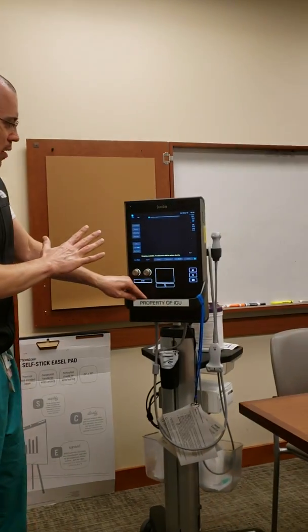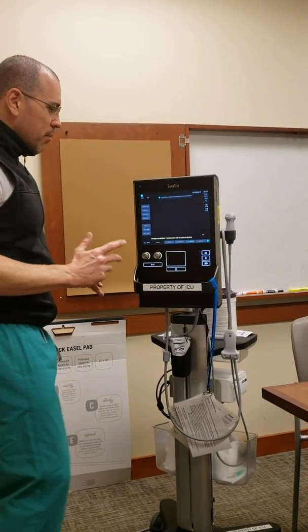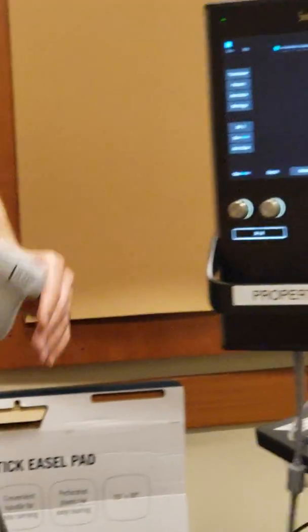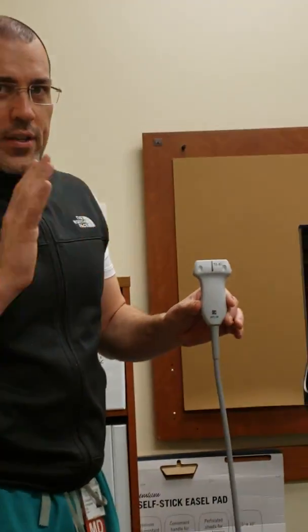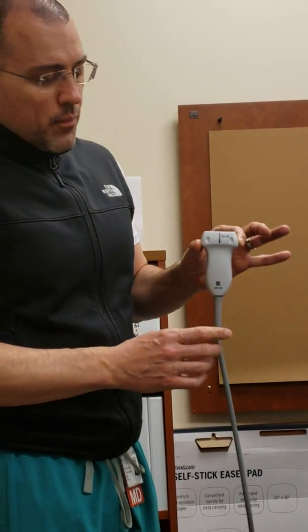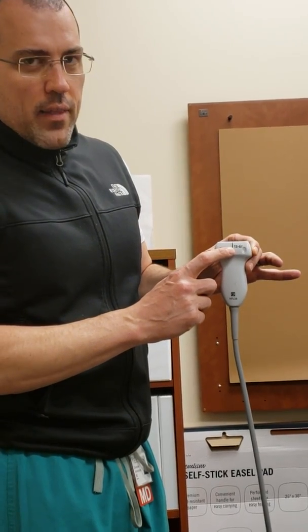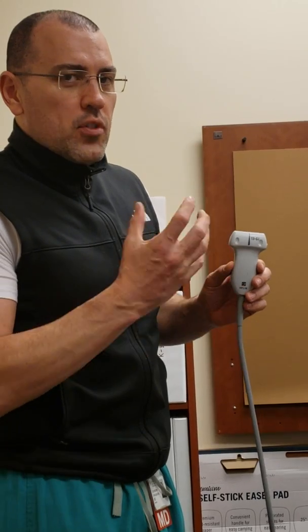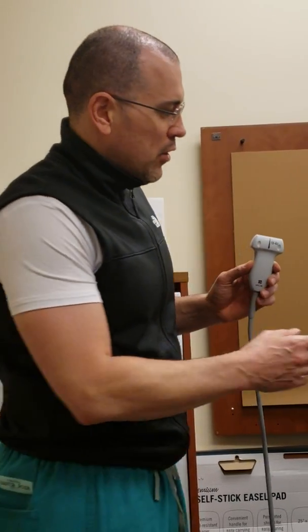This wide probe here is always the probe for lines. It uses a piezoelectric crystal and has a high frequency, which gives it very good resolution — that's why we like it for vascular and nerve structures. However, it can only go so deep because of that high frequency and high resolution.